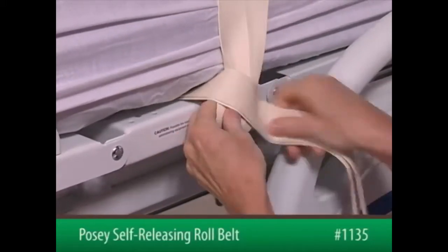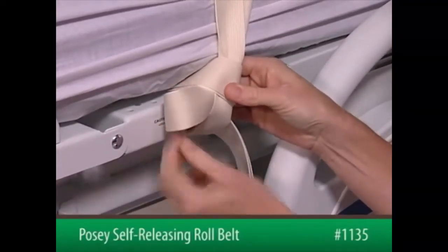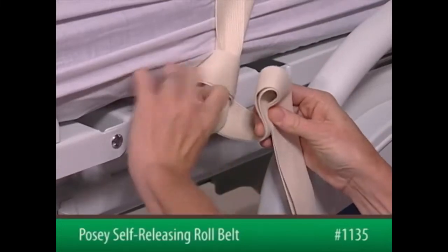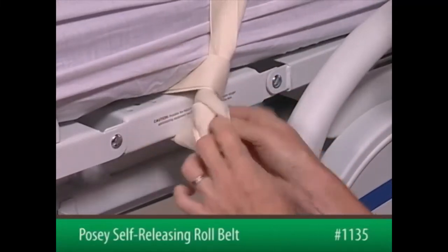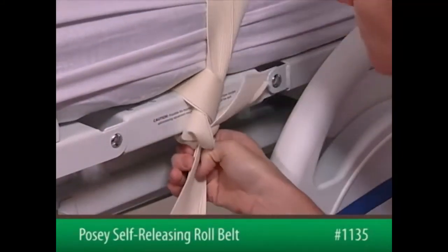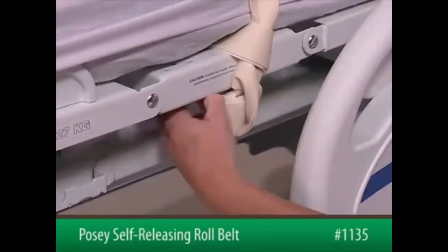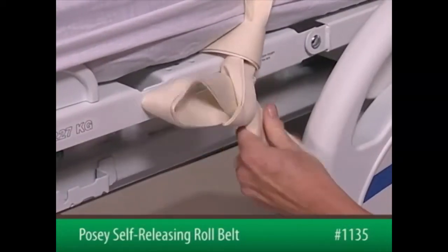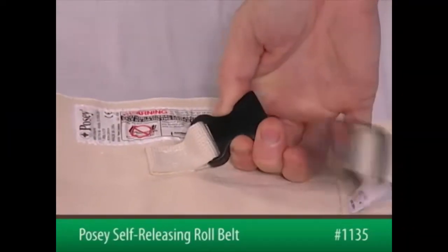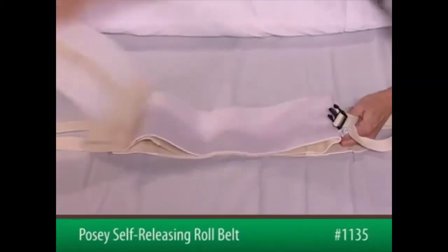Bring the straps across and then behind the vertical straps to form a loop. Take the ends of the straps, form a second loop, and bring them through the first loop. Pull to tighten and tuck any excess strap out of reach. To release, pull on the tail of the straps. After securing both sides to the bed frame, release the quick-release buckle and open the belt.